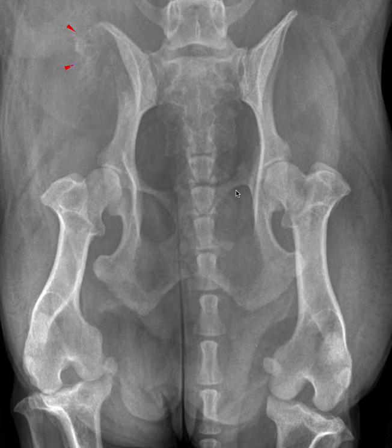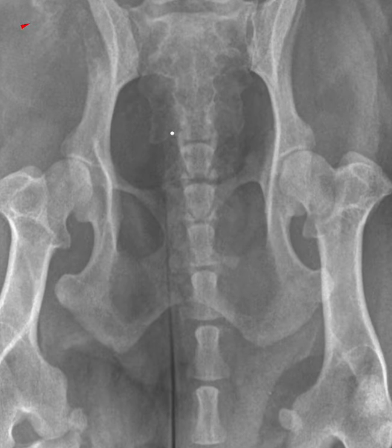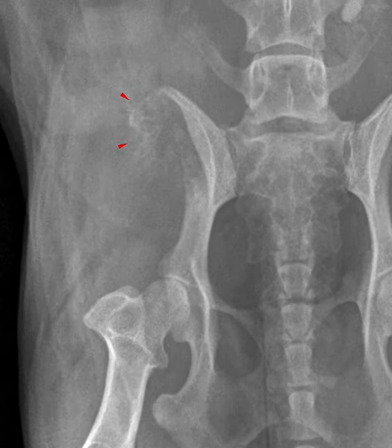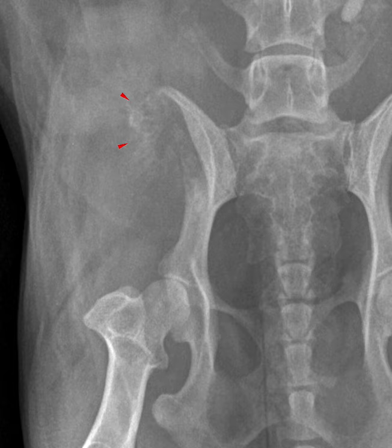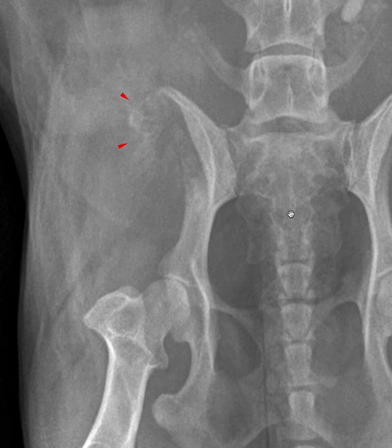When I find a bone abnormality, I then categorize it in a very simple way. Bone is limited in its ability to respond to disease and physiologic cues, so I categorize any suspected bone lesion as either aggressive or non-aggressive. I use four criteria: bone lysis, periosteal reaction, zone of transition, and rate of change. We're going to go through each of those things with cases.